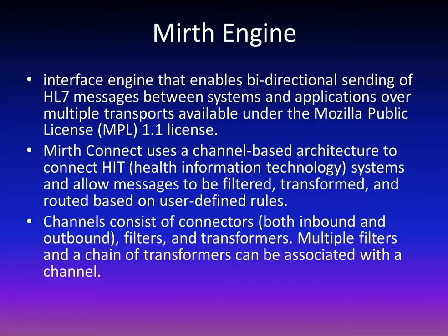So what will happen at this point is that the report is going to get inserted into the EMR, the electronic medical record system, via an interface. Just to keep in mind, an interface for individual clients right now is going to cost us anywhere from about $1,000 to $3,000.